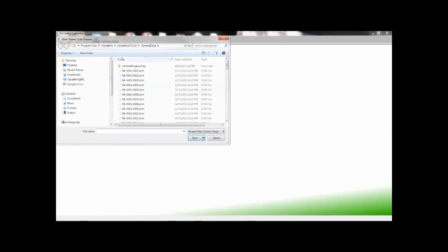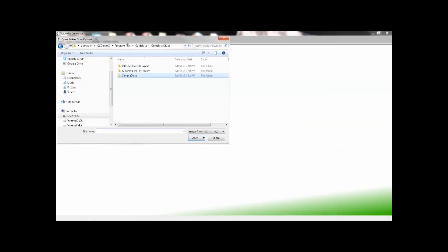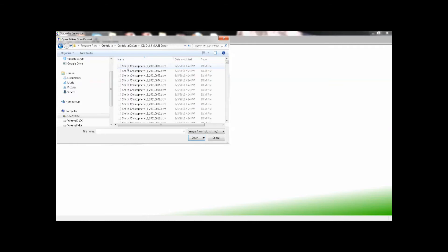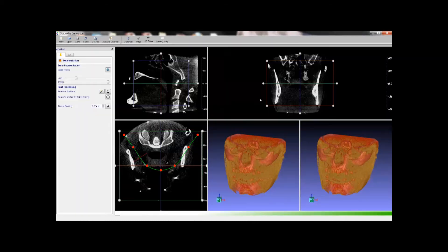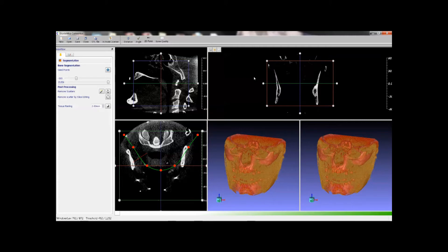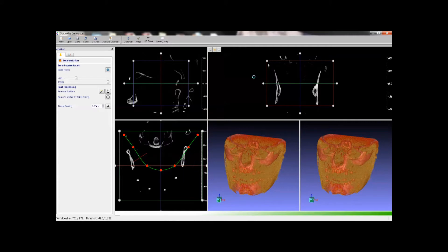In the second case, we open the DICOM files. Have a quick overview of the case by changing the thresholds and region handles. Now start the segmentation.